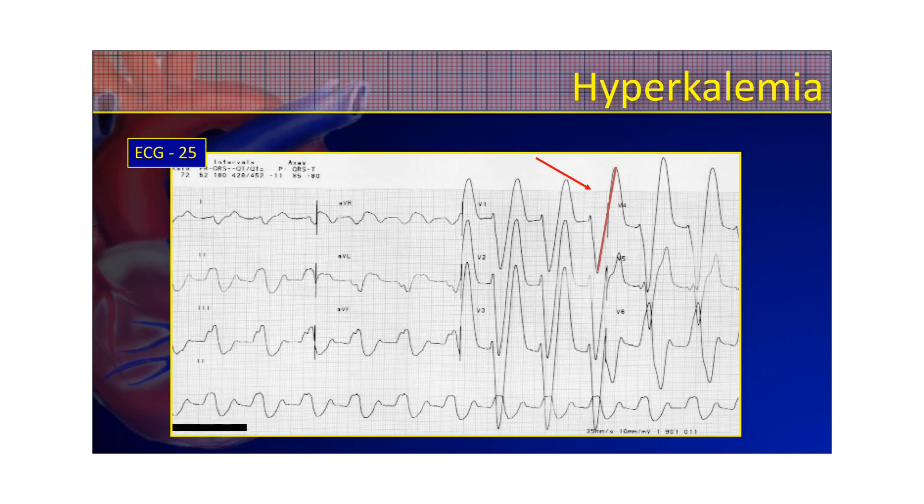And here we have an example of a sine wave. Now this is severe hyperkalemia. This patient's potassium is very elevated, and this is close to being lethal. This patient might not live very long. Look how wide those QRS complexes are. That's much wider than any ventricular rhythm. So this patient has a severely high critical level of potassium and is at very high risk of going into cardiac arrest.